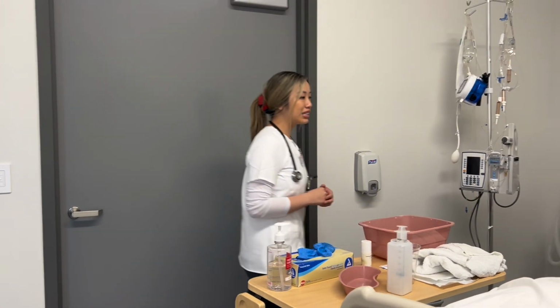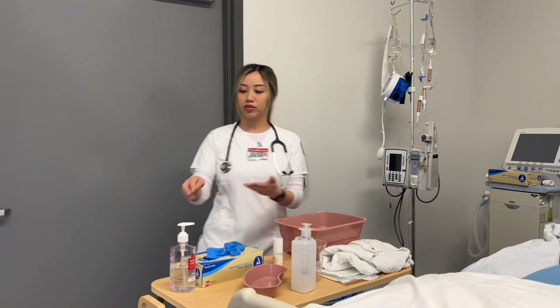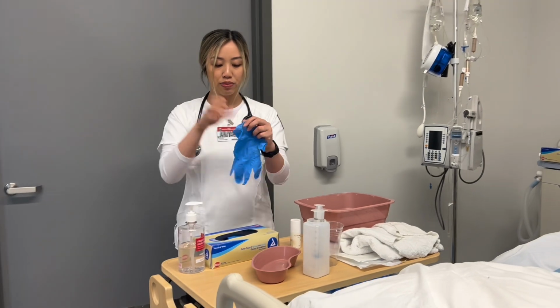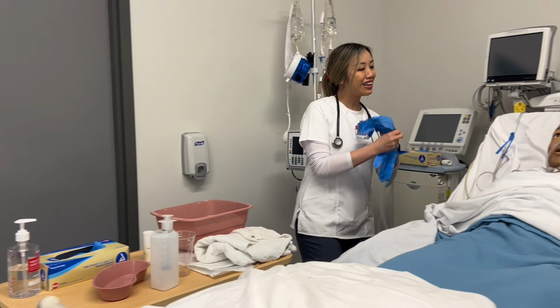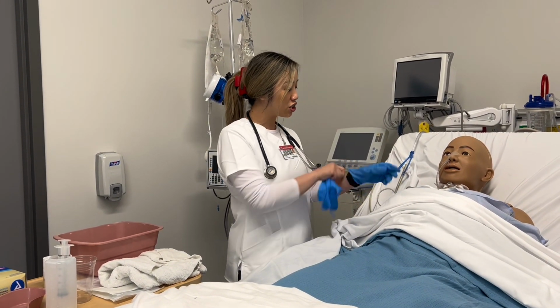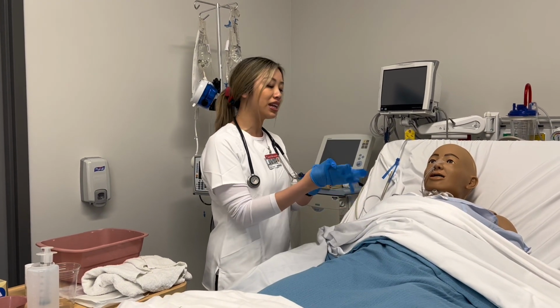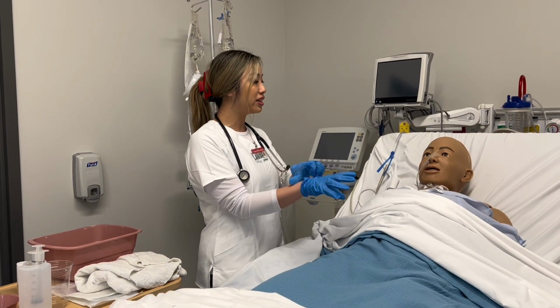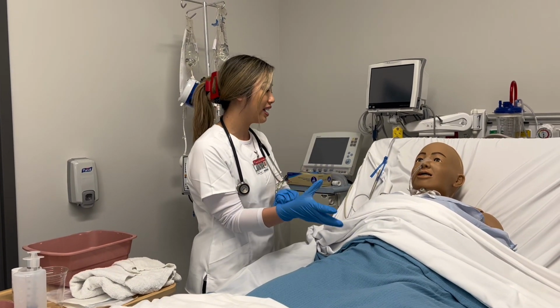Okay, so now I'm gonna go ahead and film removing the NG tube. So I would go ahead and knock on the door. I would go ahead and perform hand hygiene again, provide privacy. Hi, Mr. Smith. I'm back. So I see that there's an order. Good news. I checked the chart too with the doctor that we can remove your NG tube today. It seems that you're eating really well and taking your meds. So I'm sure you're excited to take this tube out, okay?